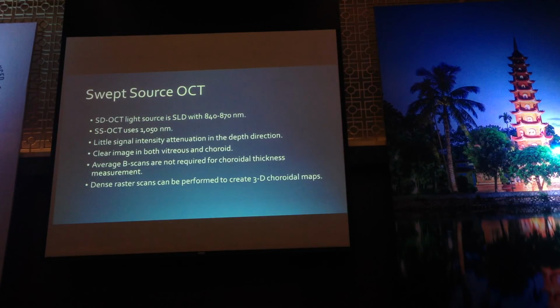But for this new machine, the swept source machine, you need new hardware because the light source is different. The SD-OCT uses a light source which contains the SLD, as I mentioned to you earlier, a superluminescent diode around 850 nanometers.